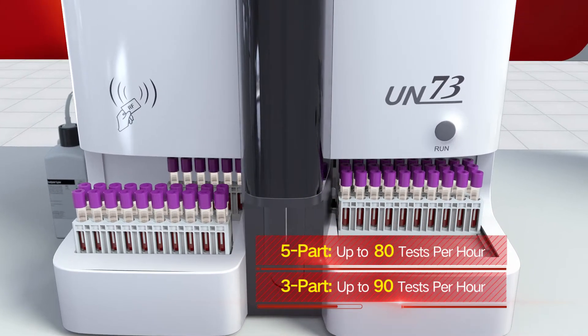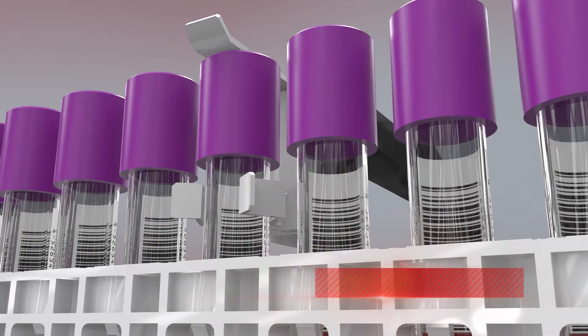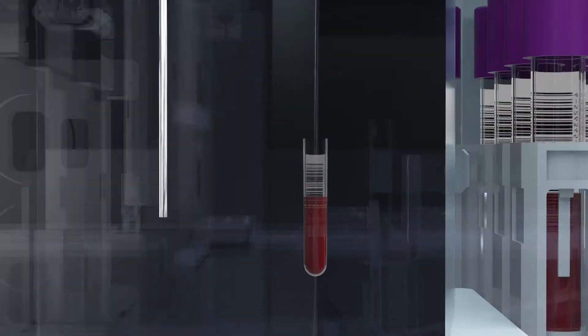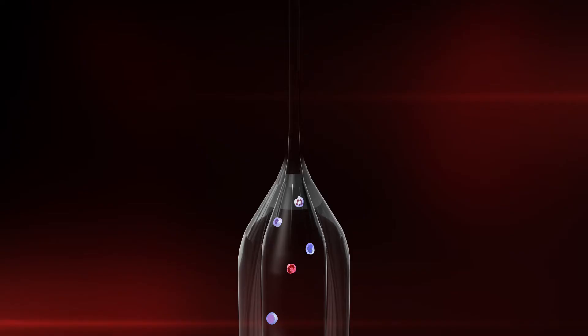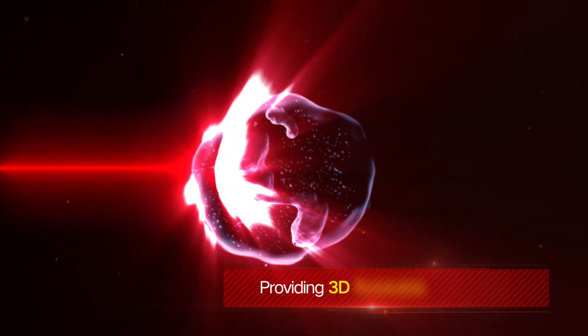The analyzer supports up to 80 tests per hour for five-part and up to 90 tests per hour for three-part. Automatic sample mixing prevents blood cell sedimentation, and 20 µL low sample aspiration reduces discomfort for patients.